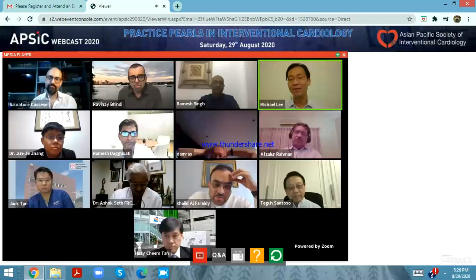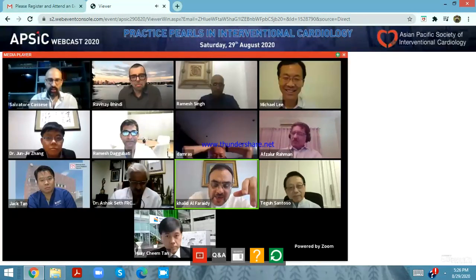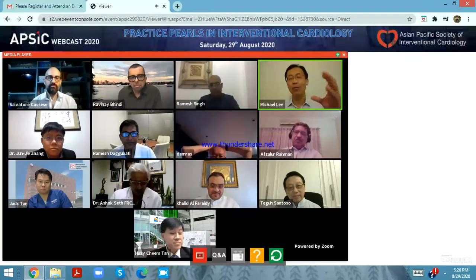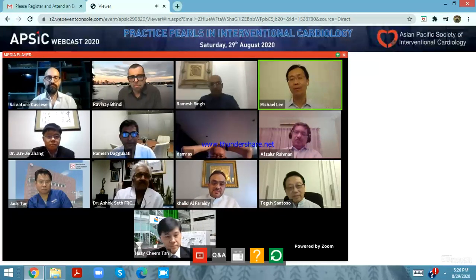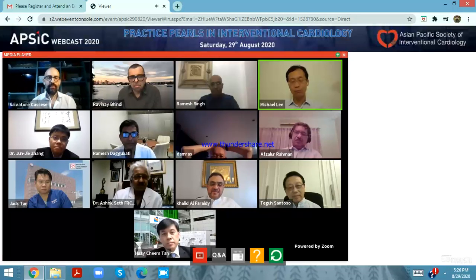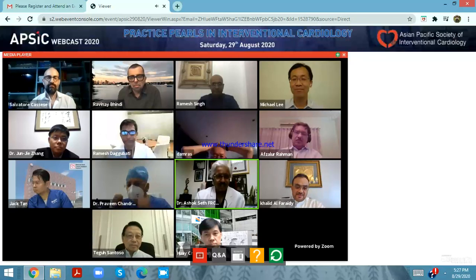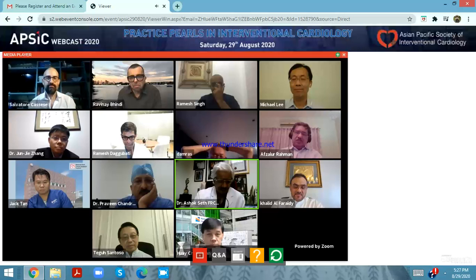But you have to leave the balloon for 10 seconds. If the patient has severe LV dysfunction, might they not tolerate it? Yes, that's right. But the cracking is actually very soon. The second and the third pulse, you will see the cracking. Correct. And you can be cumulative about the pulses, so you don't have to deliver the 10 all at the same time. You can deliver 5 even, and then deliver to 10. But 10 seconds everybody tolerates.